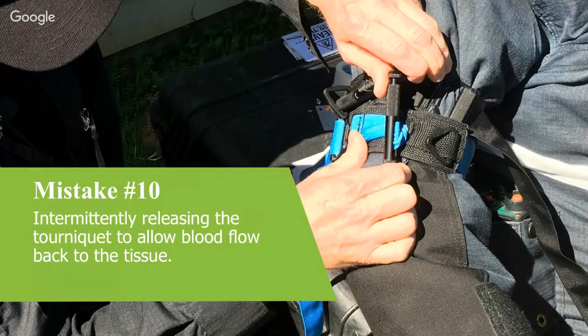Yeah, certainly. This one is one that pops up, and the theory behind this, first of all, it's an absolute no-no. You just do not do this. The theory behind it is that if you've got a tourniquet on for a long period of time, you're cutting off all the blood supply to the tissues, you're denying them oxygen, you're stopping any of the waste products that are building up in that limb from coming back into circulation, and they can build up to toxic levels.